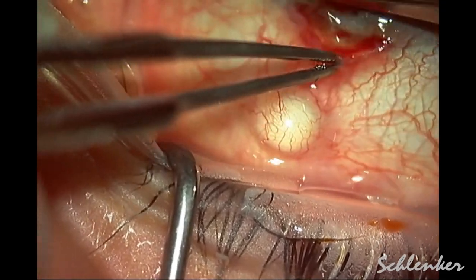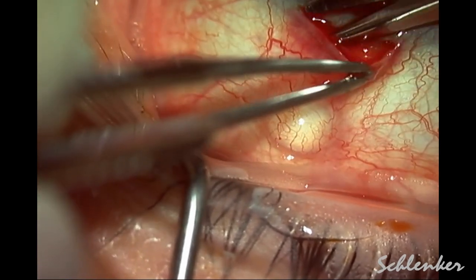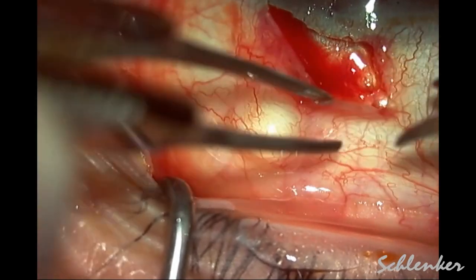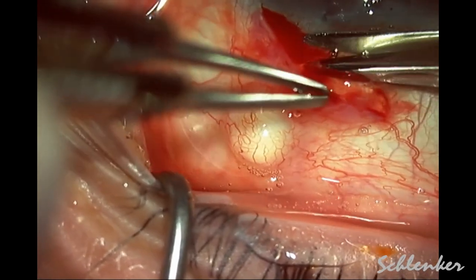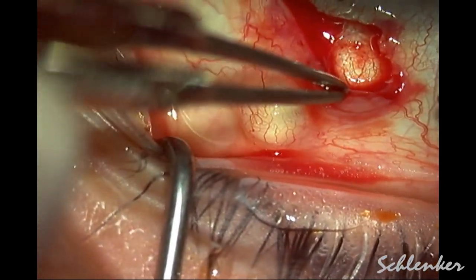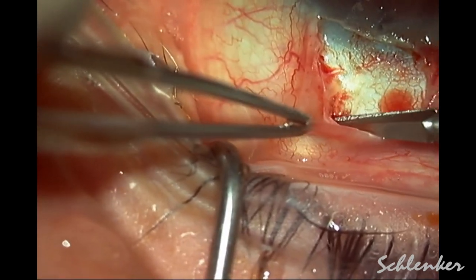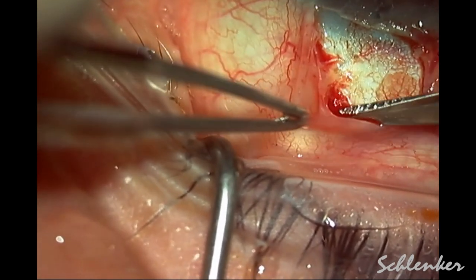You can see here we are doing this under topical anesthesia with a peritomy to open up the area. We felt we would need a radial incision as well to really access this area. I would caution any of you doing revisions with the Xen micro stent that the stent itself is incredibly fragile, so great care must be taken in the dissection.